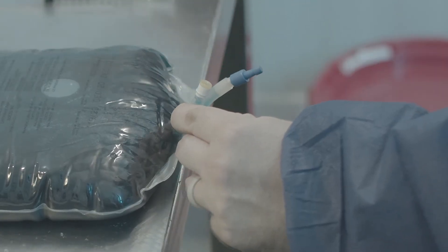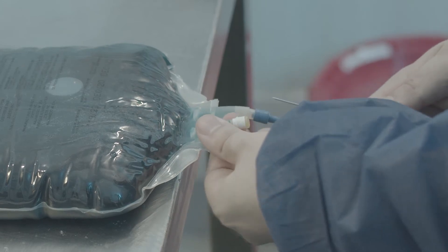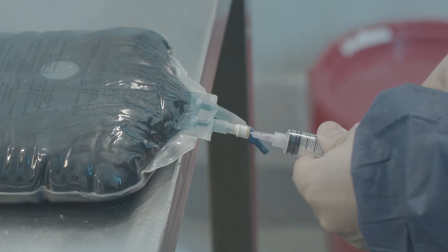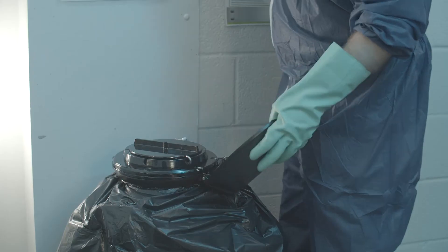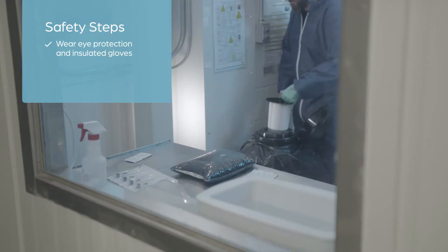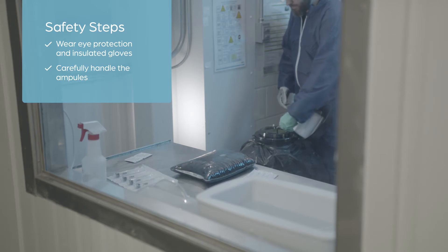Once you're ready to start the thawing process of the Marek vaccine, prepare a syringe to receive the vaccine. Draw 5 milliliters of diluent into a 20-milliliter syringe with an 18-gauge needle that is one and a half inches long. This small amount of diluent begins the process to buffer the vaccine. Next, remove vaccine ampoules from the liquid nitrogen container following these safety steps: always wear eye protection and insulated gloves, and avoid inhaling liquid nitrogen vapor when checking levels daily.